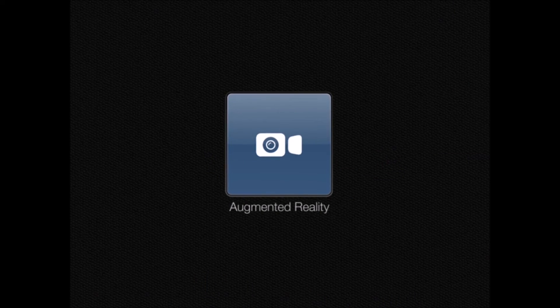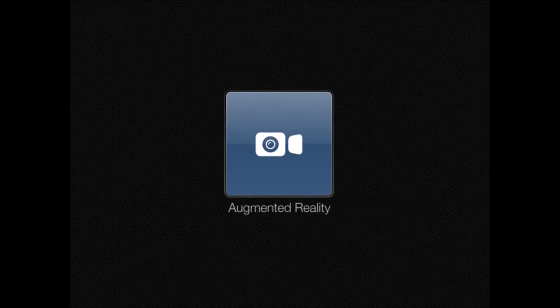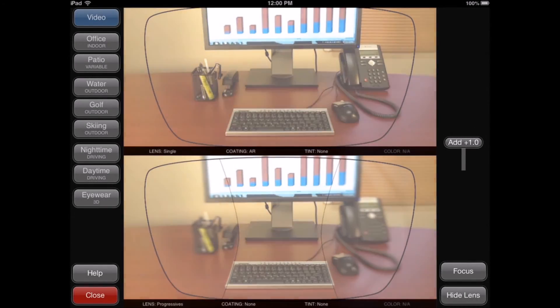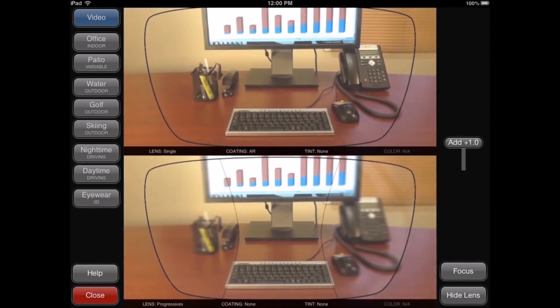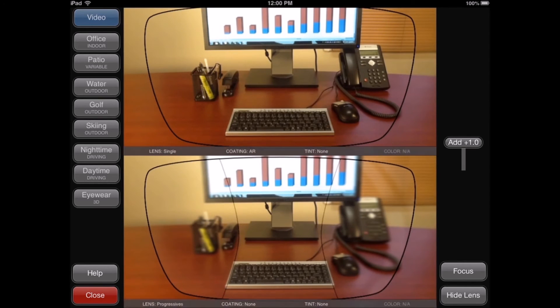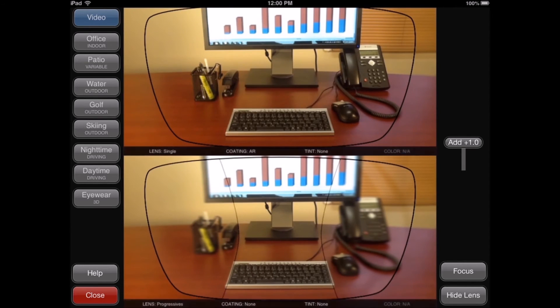When launching the augmented reality module, you are presented with two live video windows. Below each video window, several lens options can be selected.